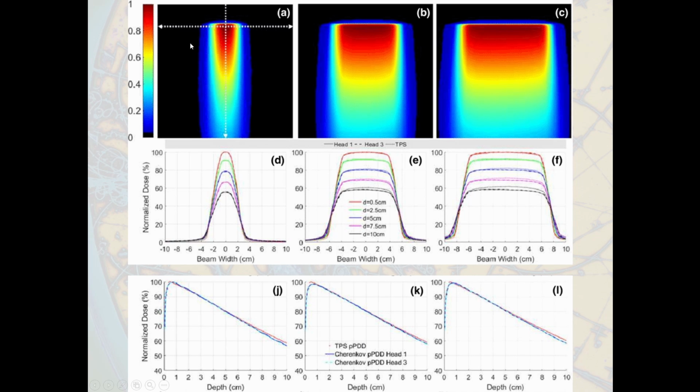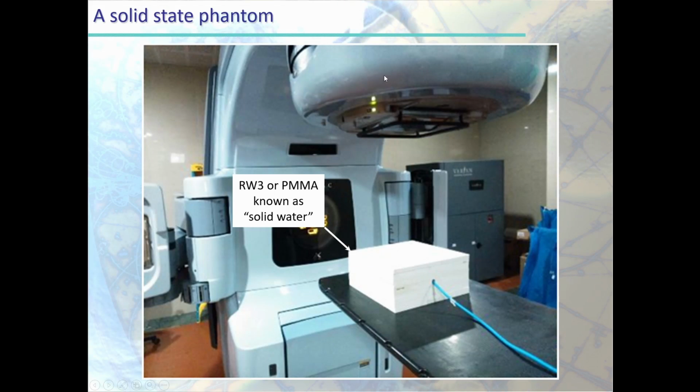And if you look at the lateral profile, you will see that you have almost no dose on the side, and it starts to rise up, gets its maximum, then falls down on the other side. Okay, and when you increase the size of the beam, let's say from 5 to 10 centimeter, you keep on having the same shape in the central line, and you have a different shape, as you expect, in the lateral profile.